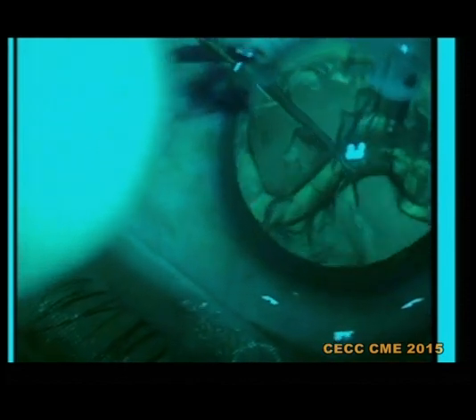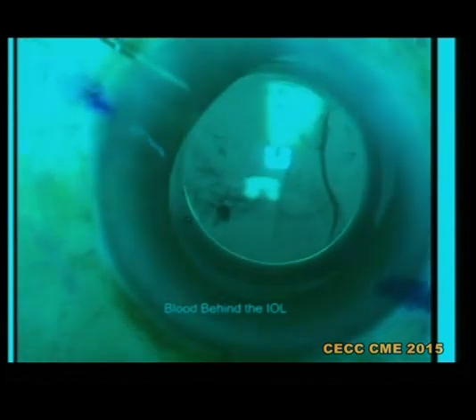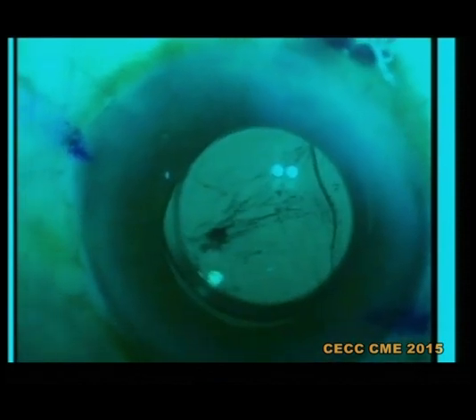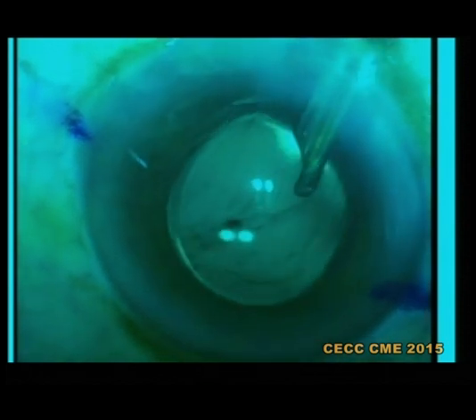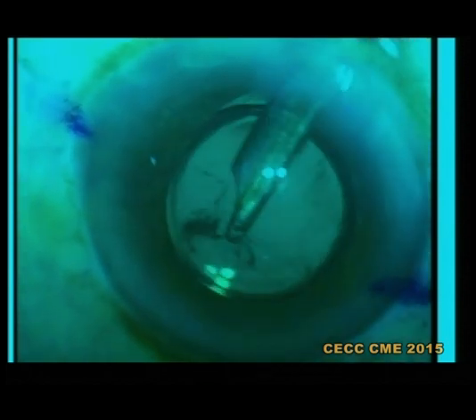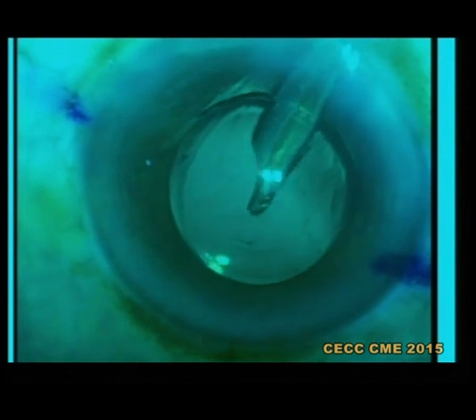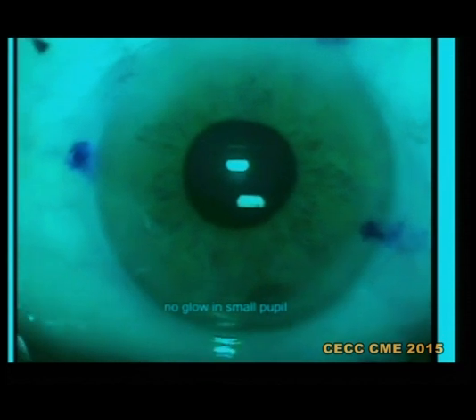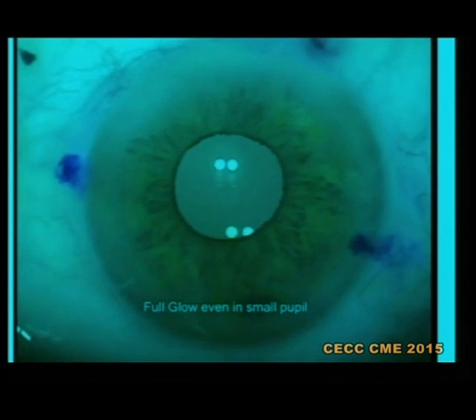I made six units to do a multicenter clinical trial and nobody is giving me back. The blur behind the eye — you will see the clarity improvement. There is no glow in small pupil when the conventional light is on, but a full glow when the dual stereo coaxial illumination is on.